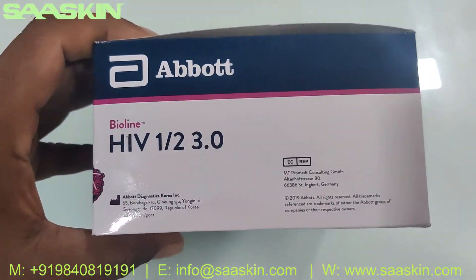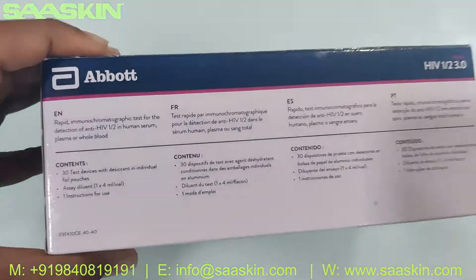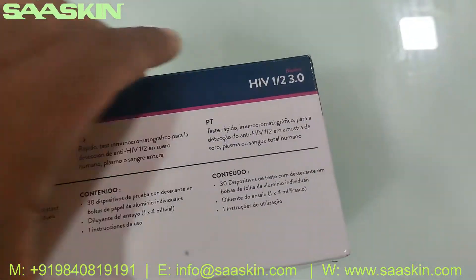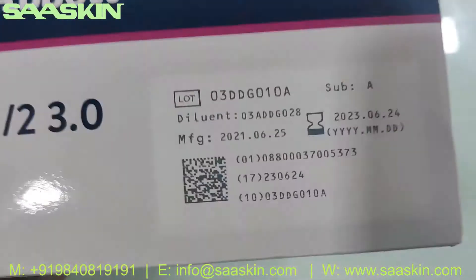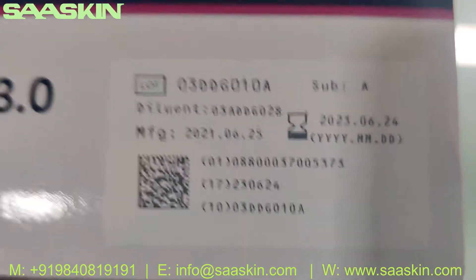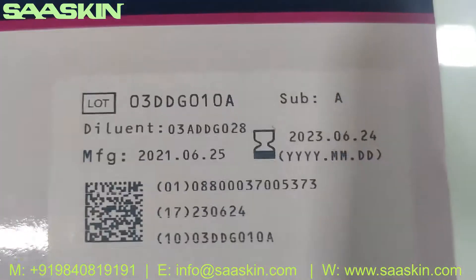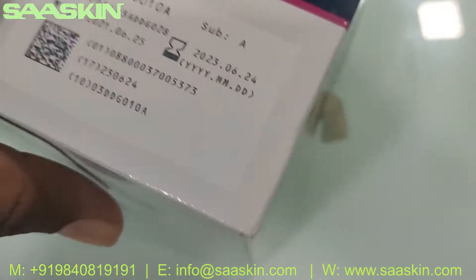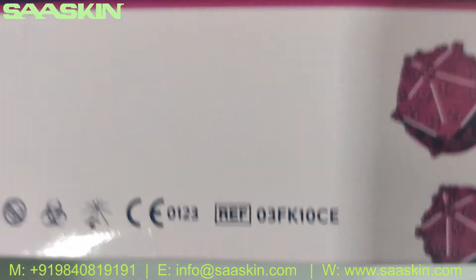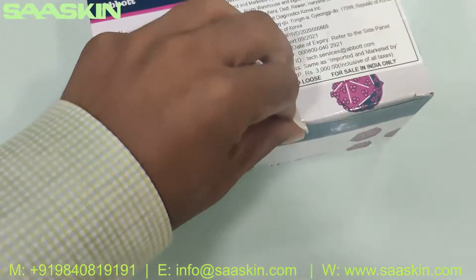This is what the box looks like. You can get the instructions here. On the label you can see two years of validity, and you can also see the part reference number here.